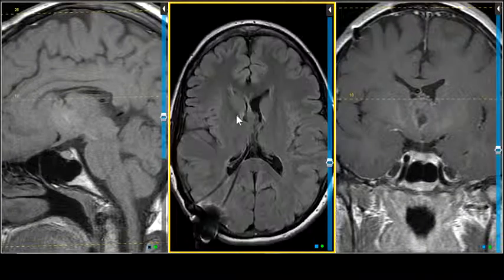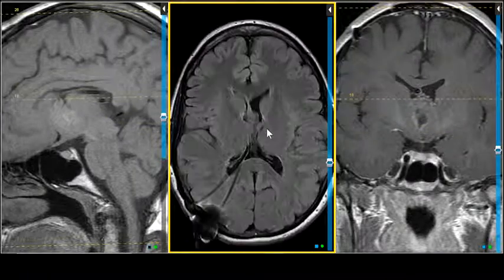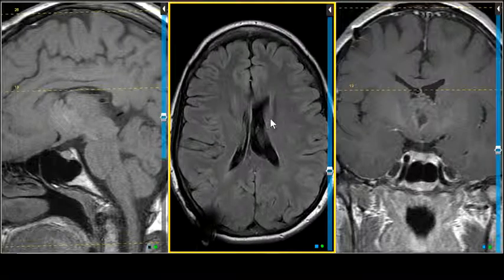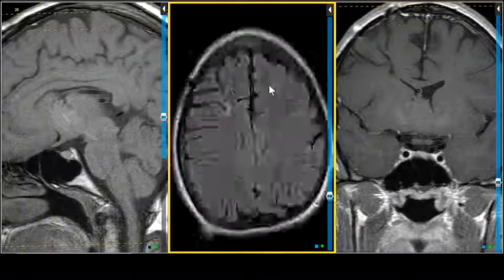Right. But at any rate, there's a bit of tumor left, but they got some kind of decompression of hydrocephalus, although once again, I think the fact that there is differential drainage is something we might want to keep an eye on, make sure this is not bigger next time we look at it, and suggest that it should be looked at to make sure that this lateral ventricle is not getting trapped. And they say there's a transfrontal.